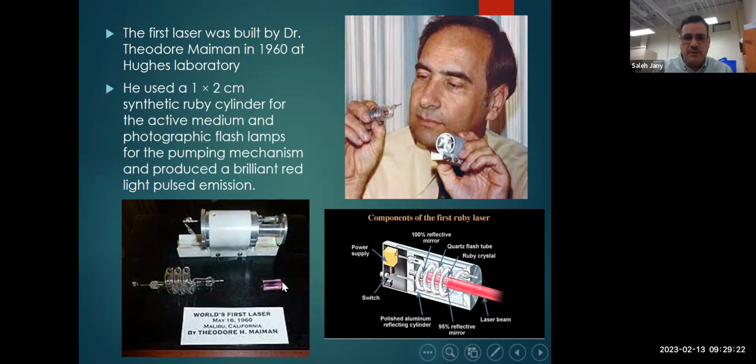The edges he made so polished that if there's a stimulation, the photons will go and come back and keep stimulating each other until, in the end, one of the mirrors is partially emitting. So in the end, we send out red laser light. He got all the recognition because he made the visible laser. Charles made the maser, which is microwave, but he didn't get any recognition.